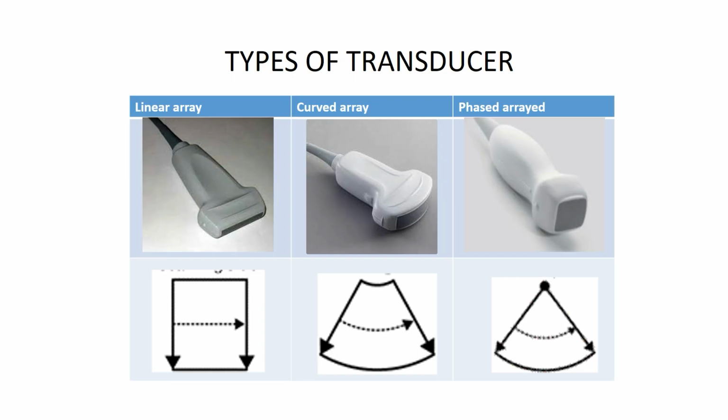The linear transducer, or linear array, contains linearly arranged piezoelectric crystals, which produce a rectangular shaped sound beam, and we see a rectangular image on the screen.